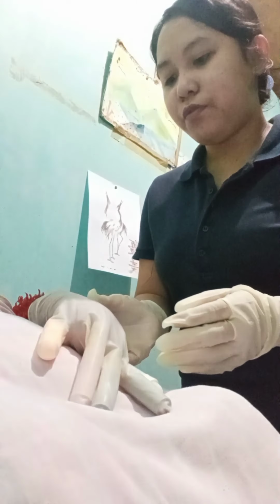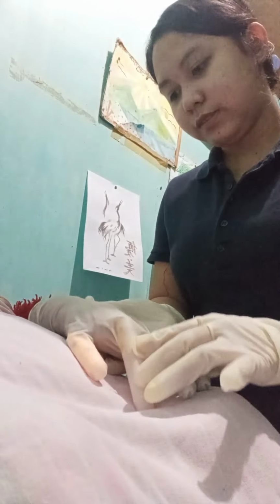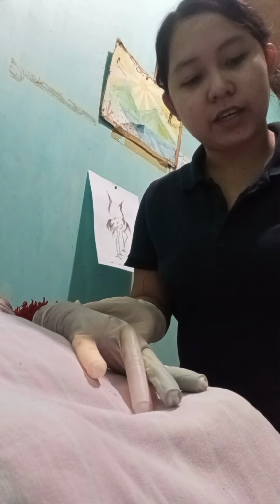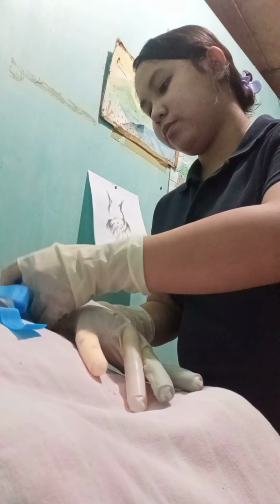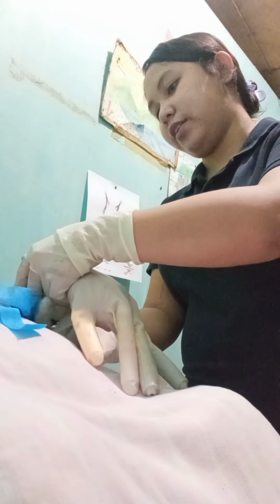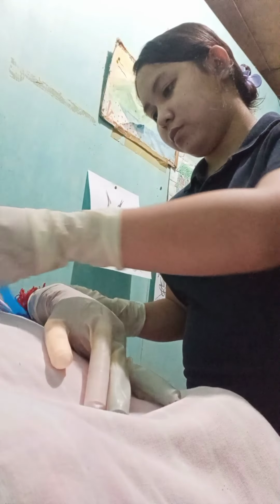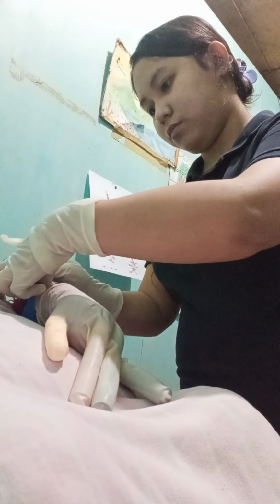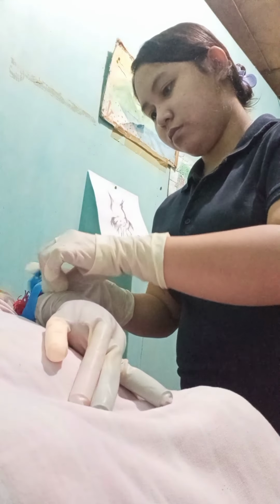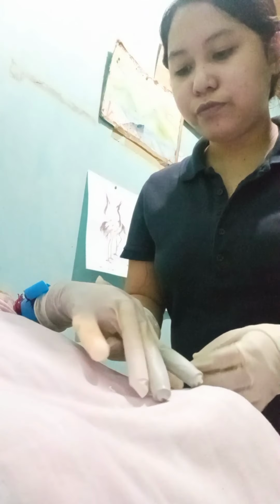Select the vein for IV placement. Then, apply the tourniquet 2 to 6 inches above the insertion site. Then, check for the presence of radial pulse.